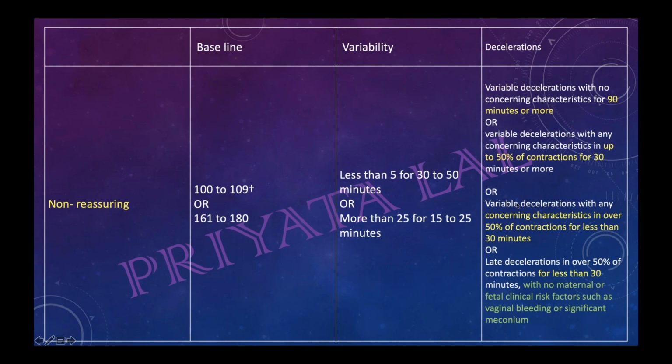Okay, so this part you have to understand. For Part 2 people, it is important. Why? Because you will get a direct question from these lines. So if the contractions are less, time is more, more than 30 minutes. If contractions are more, then time is less. So there is an opposite thing. More contraction, less time; less contraction, more time. Okay, so this you have to understand.